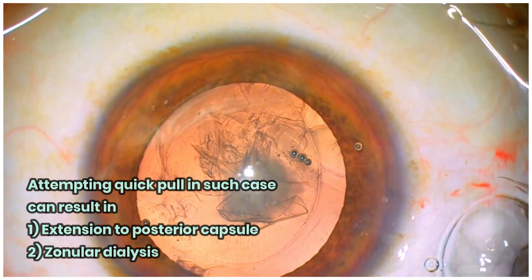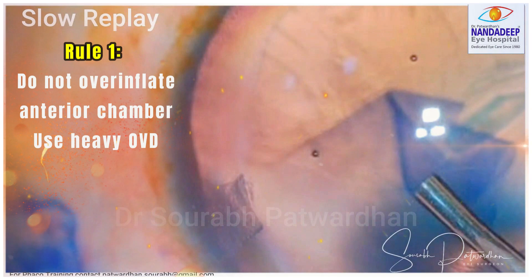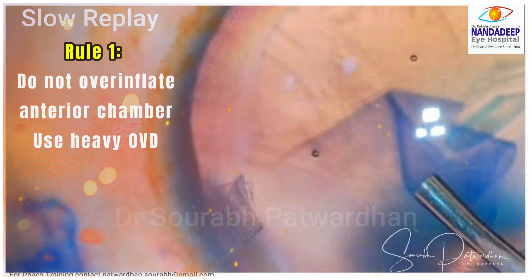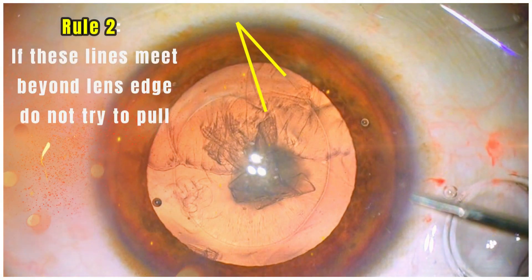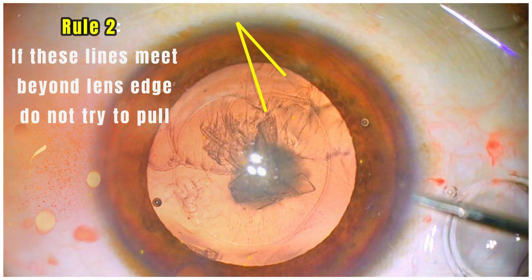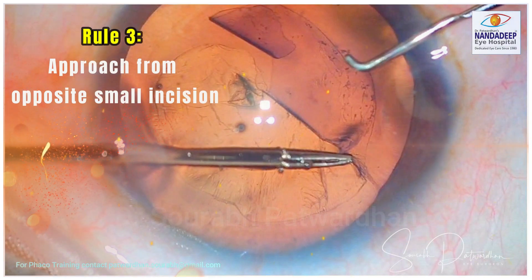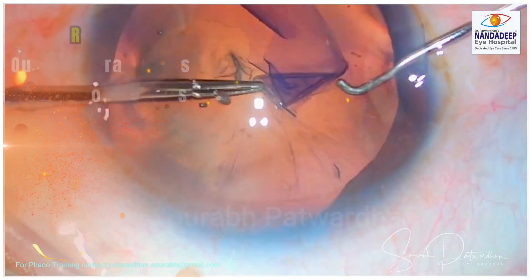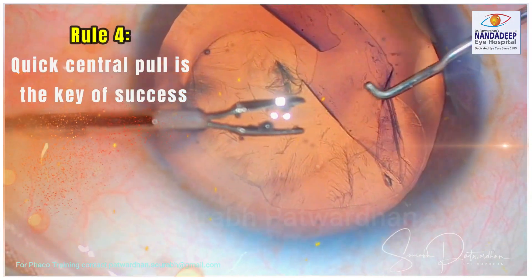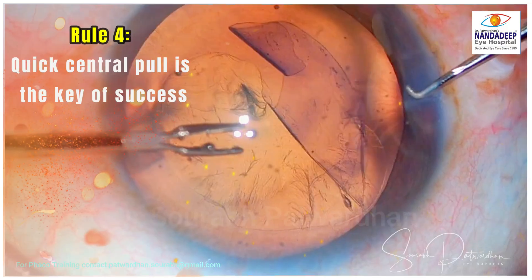So the rules of the game are: Rule one — do not over-inflate the anterior chamber; keep it optimally filled, using heavy dispersive or cohesive OVD if required. Rule two — if the tear lines meet beyond the lens edge, do not try the quick pull; you can also watch for this edge by retracting the iris. Rule three — always approach from the opposite incision and from a small side incision to maintain the anterior chamber. Rule four — a quick centripetal pull is the key to success, so do not hesitate to pull it quickly.